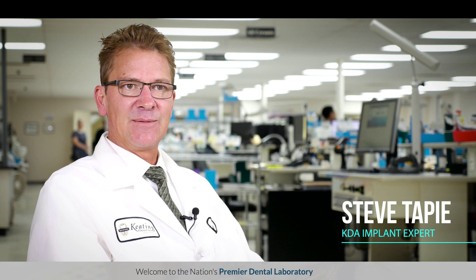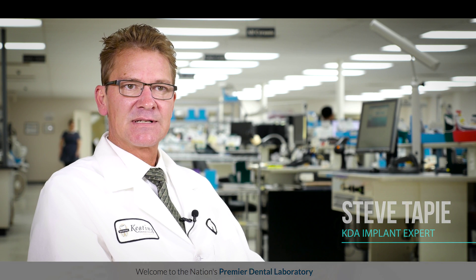At Keating we also have our Nobel Fisera scanner. We started using the Three Shape with the Nobel scanners and really started getting these abutments fine-tuned and looking really nice. We have more control on the design of these abutments because we actually fully design them here.